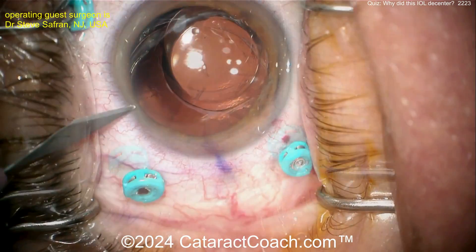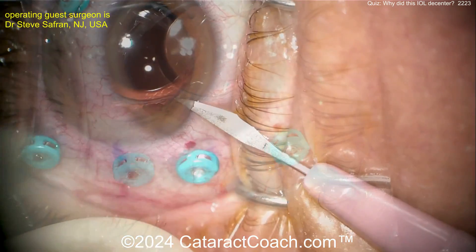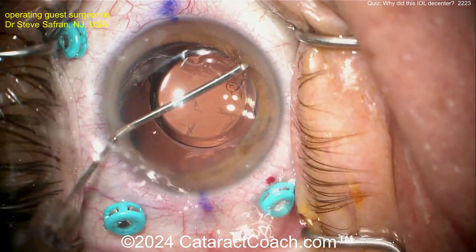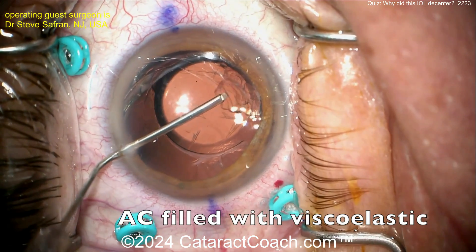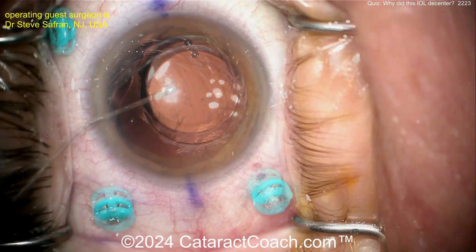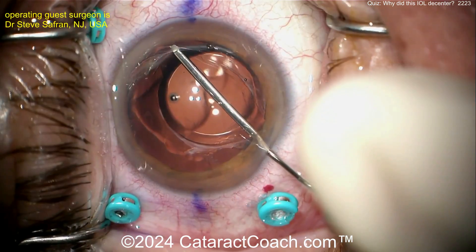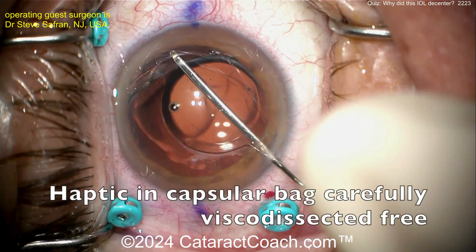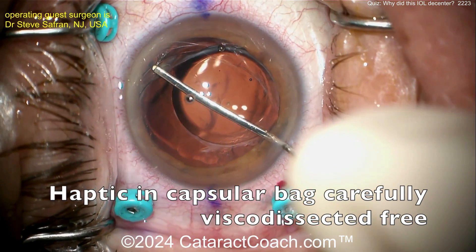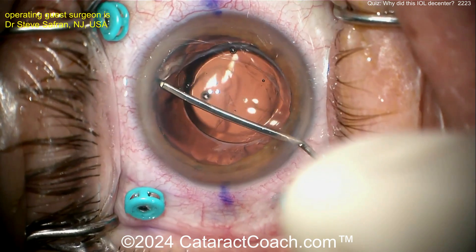He'll make sure there's no vitreous prolapse. The key to fixing this case is you've got to open up the capsule. To save this lens and get it in the bag, you have to free up that fused capsule and get that one haptic out of the sulcus and dialed into the bag.